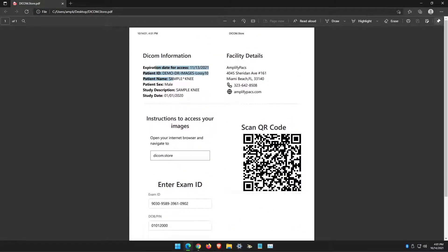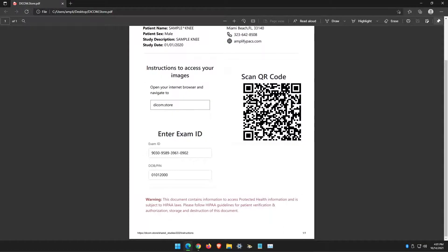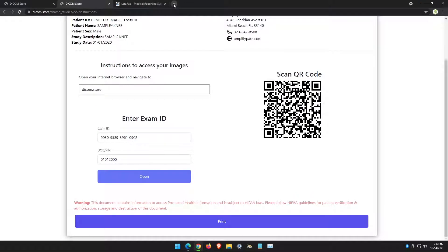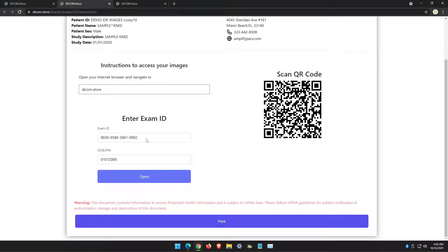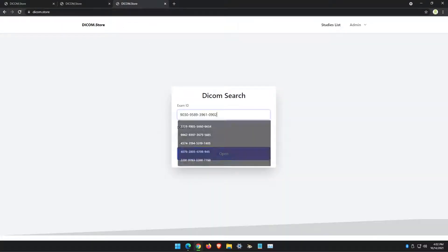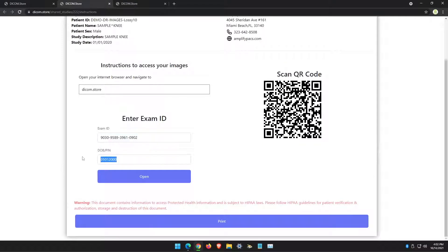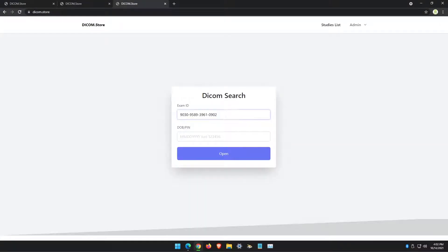Here's an example of the document that will get sent to your printer. It will have the patient's demographics, your facility information, where they go to get the images, the exam ID that they type in, and the PIN number that they type in. We're going to go to DICOM.store, enter the exam ID, and the date of birth, and click open.